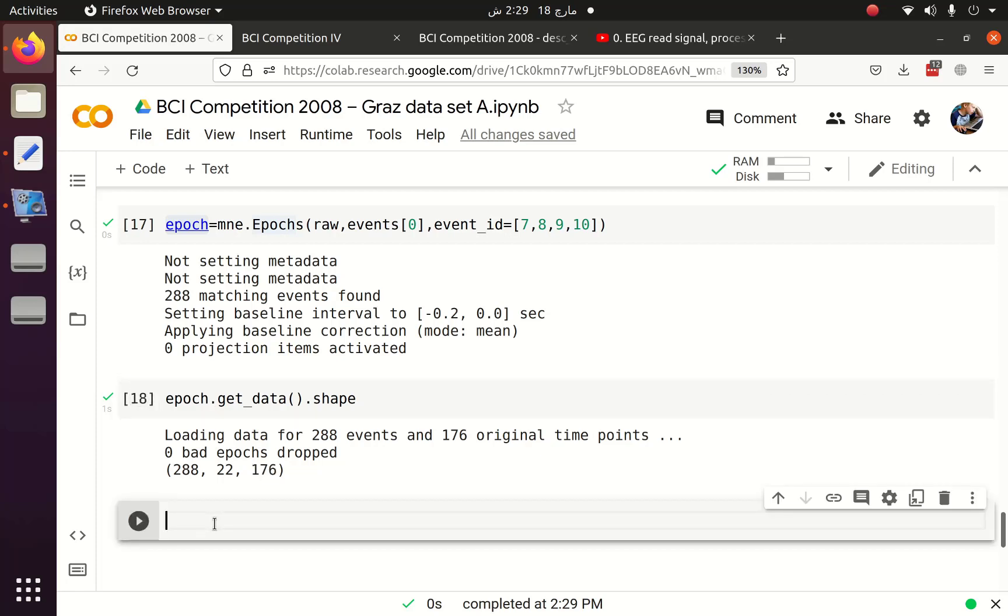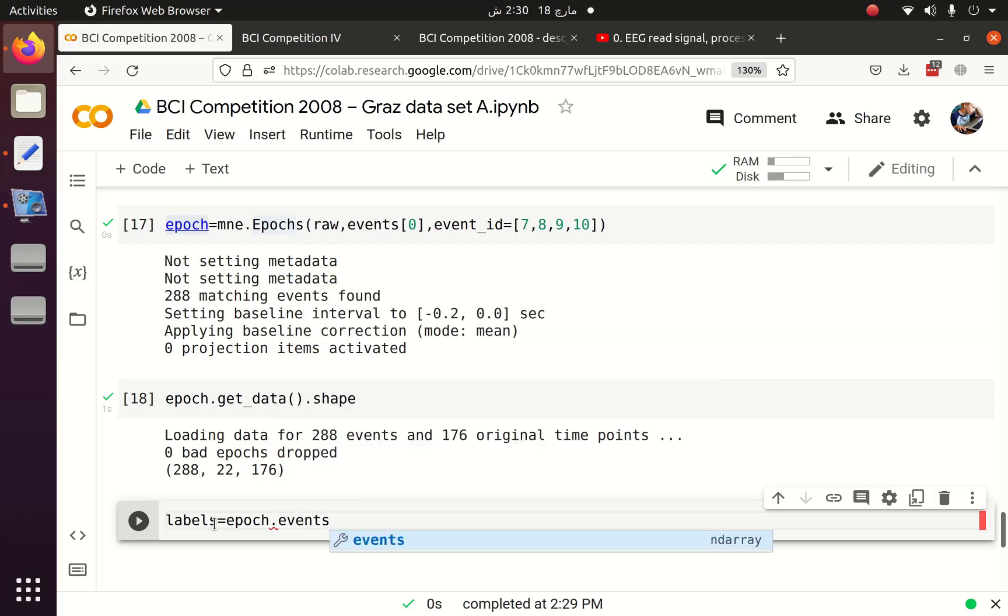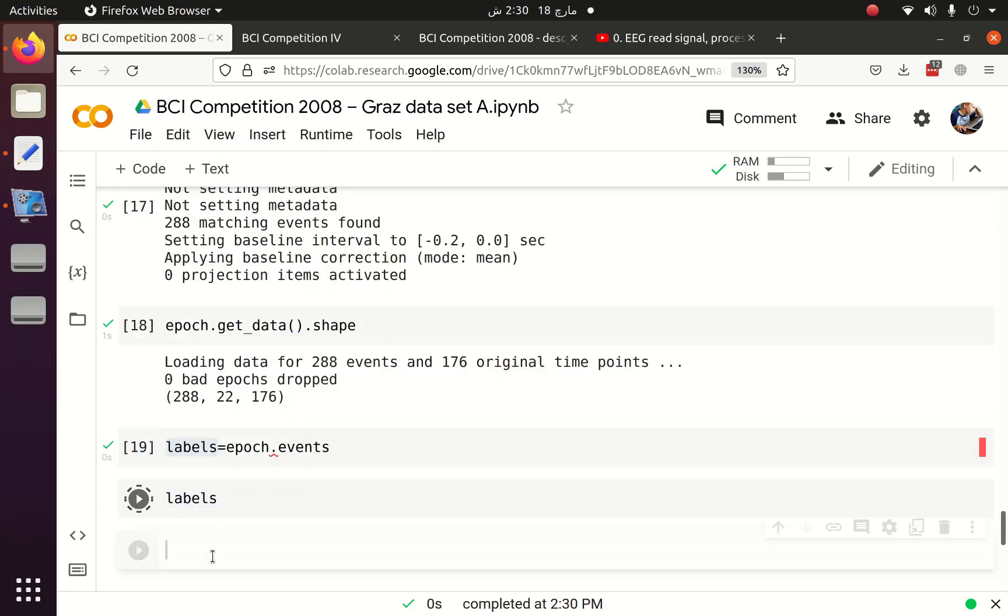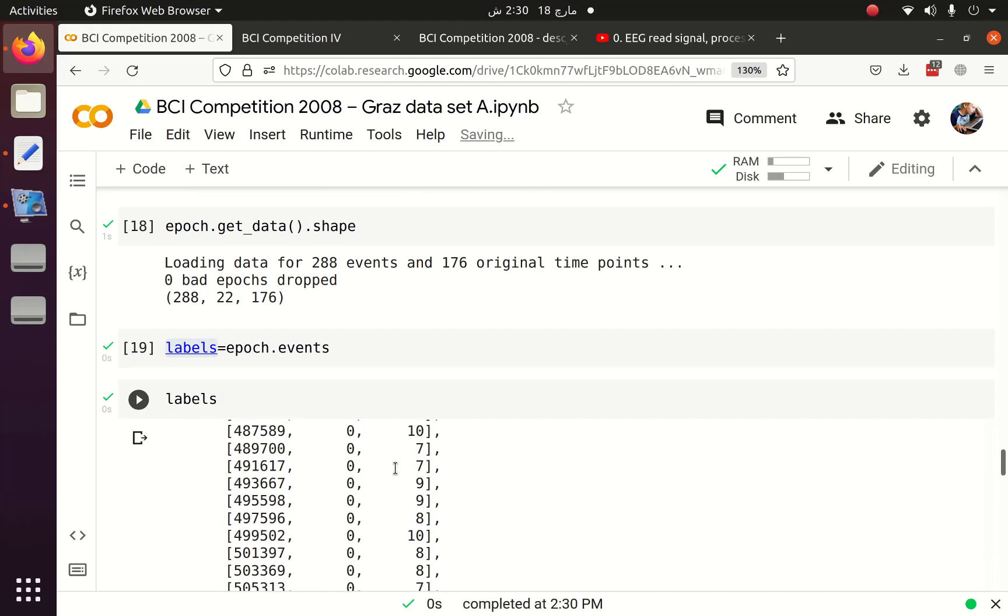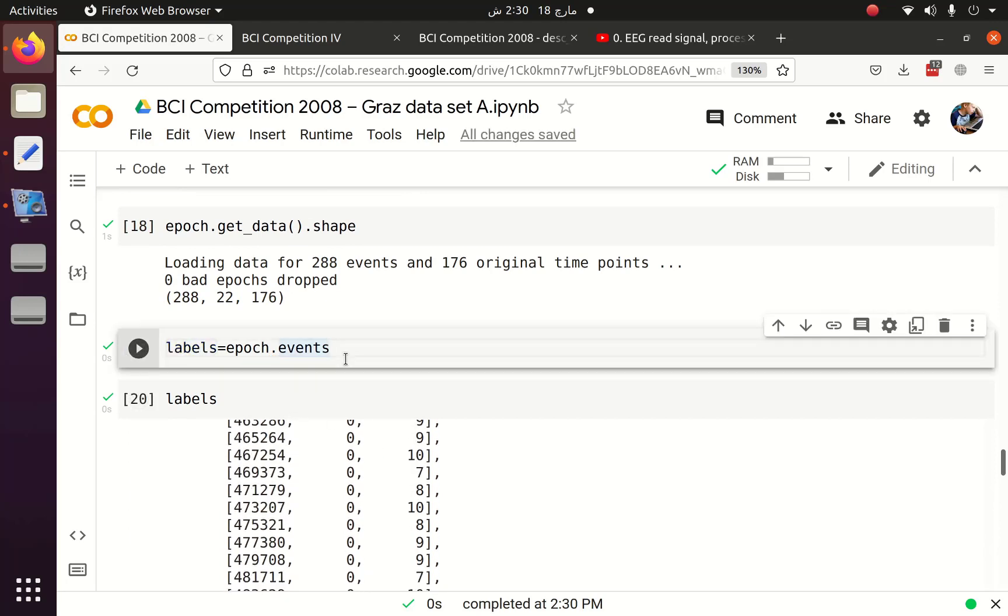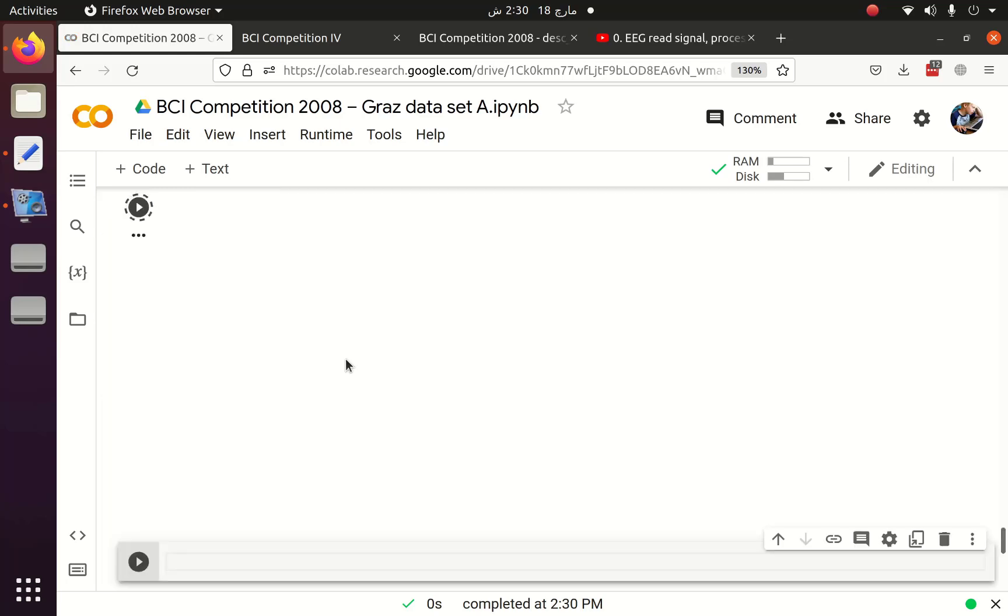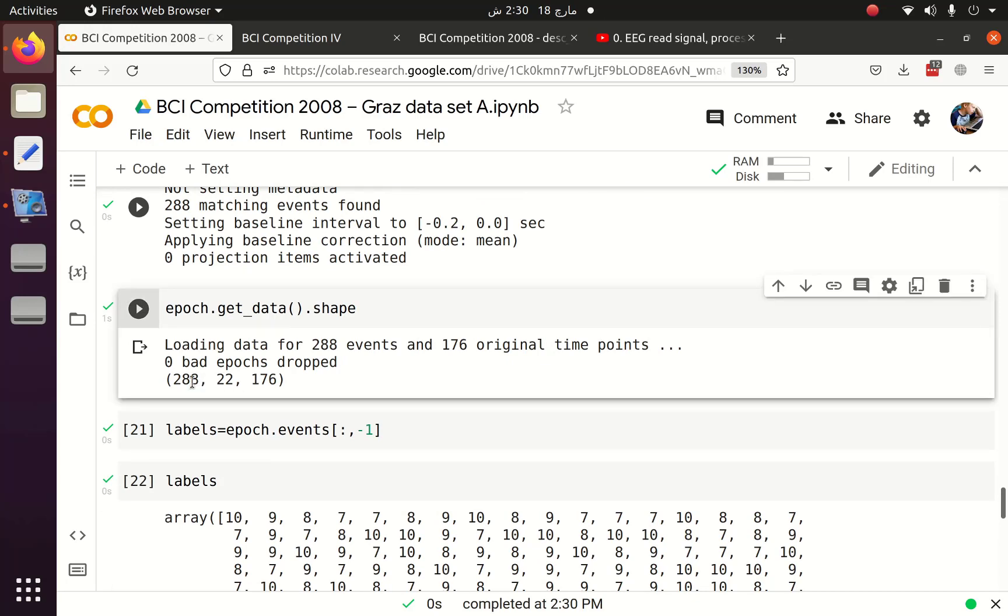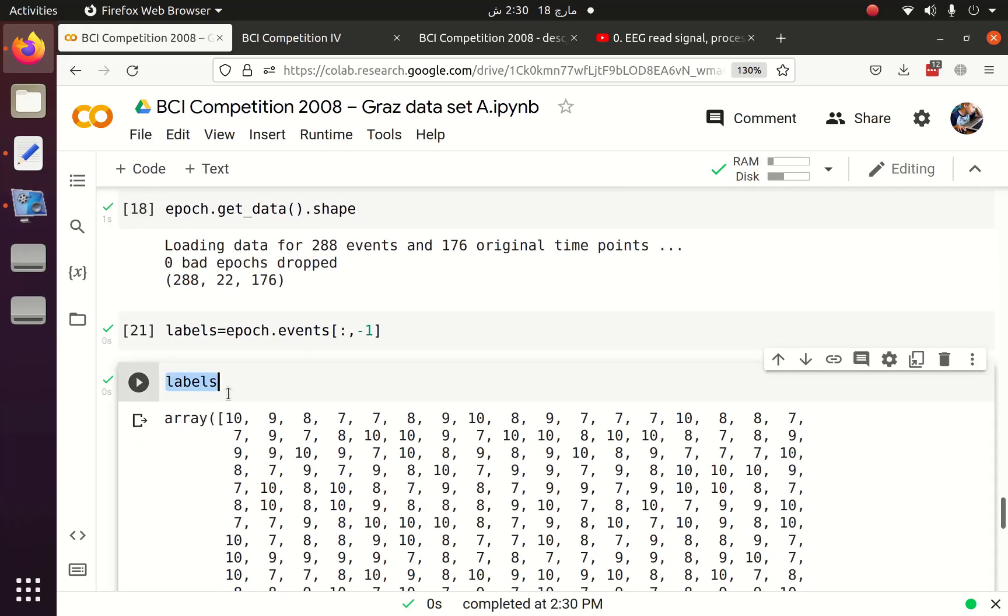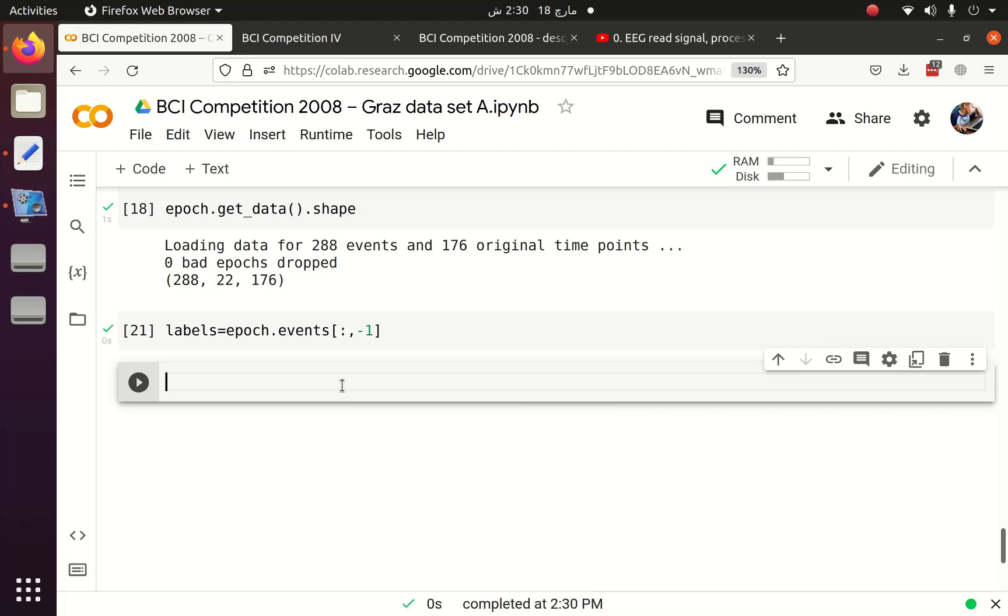After that I can get the labels from these events: labels equal to epoch.events. If I print these labels, I will get this information, but I only need this last one. So I'm going to get the last channel only. So now I have the events and the corresponding classes. So by using this technique I can do classification or whatever I want with this data. So let me create a functionality to load all of the files, but before that let me view how these events look like if we pull out them.